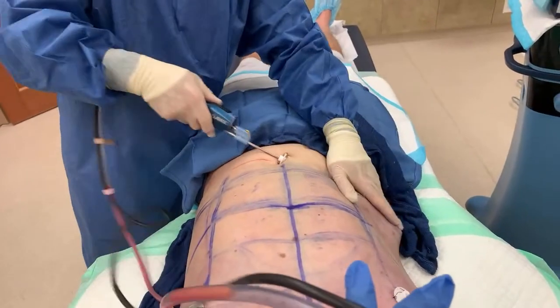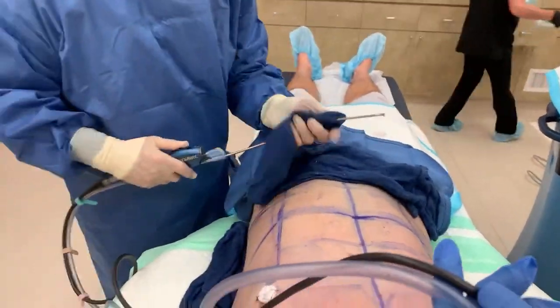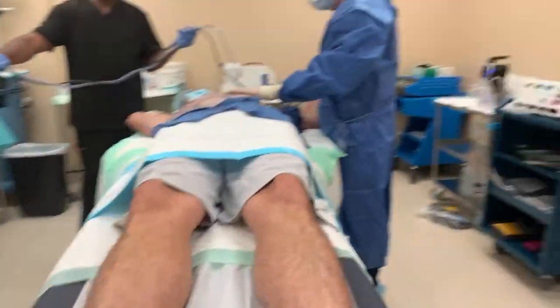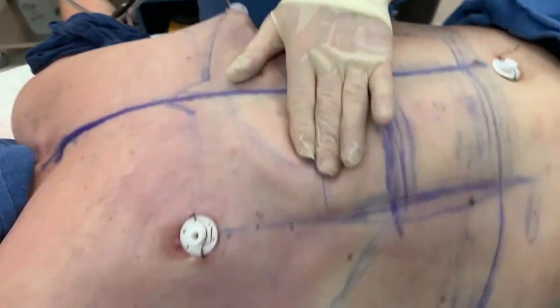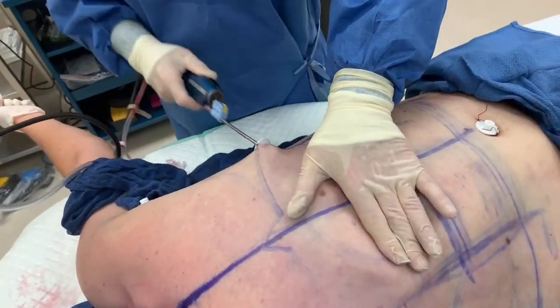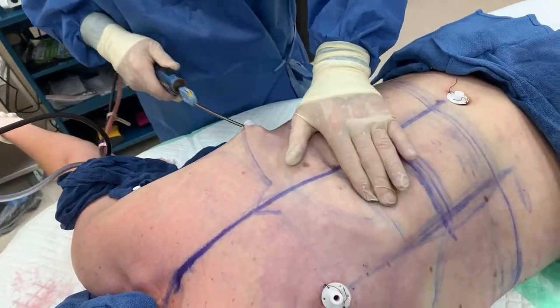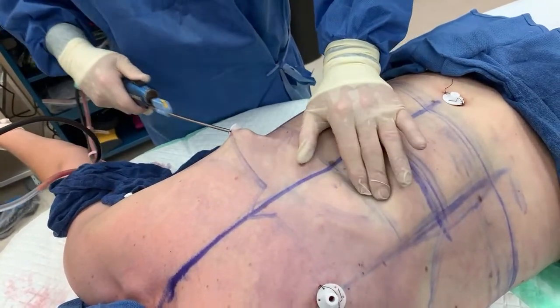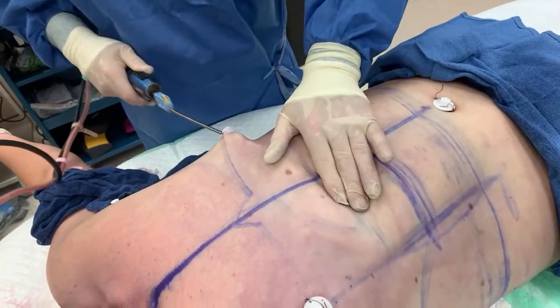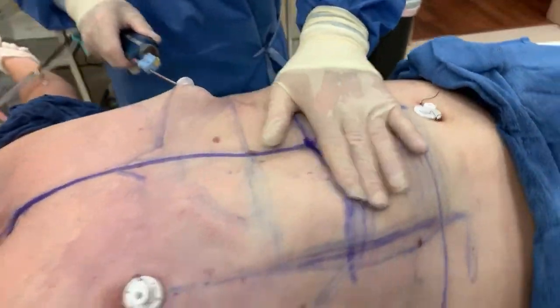Good, nice — leave it around here. Very nice. Now from this side — we haven't done this side yet. From this side, get this six-pack. Get the horizontal inscriptions from here. So that goes there, and the same thing over here — come around here and get this one.